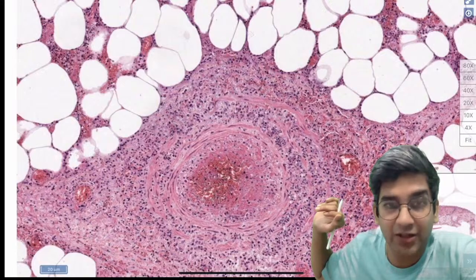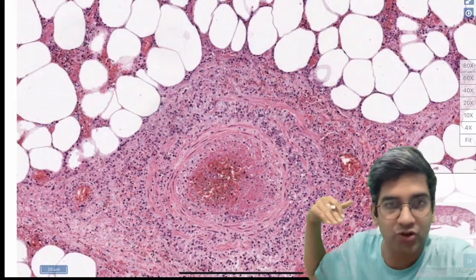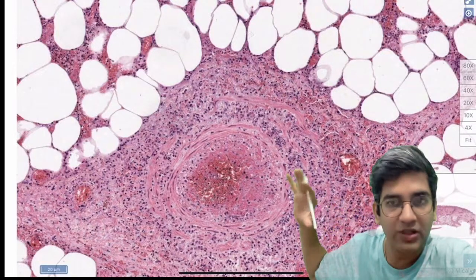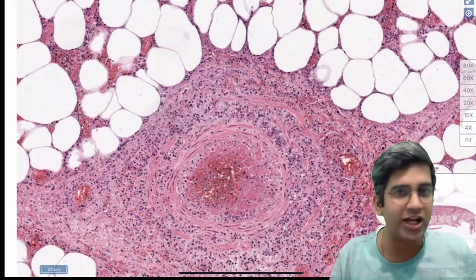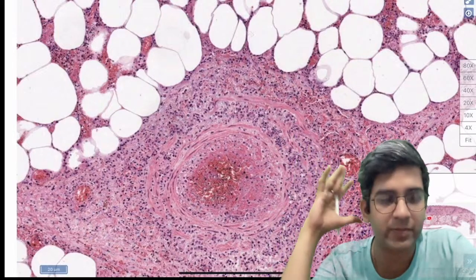Come on, guys. You are okay. Hakim has given one more bit of insight, calling it thrombus. Okay, let's come back to that, Hakim. What is this? What is the structure? A vessel. Fine. I'm not going to contemplate artery, vein, or arteriole. It's a vessel, right? All of you accept it's a vessel, like whatever Pranit said.